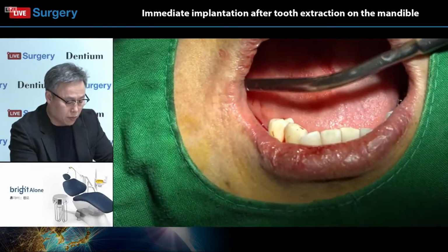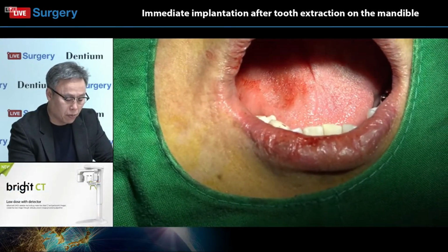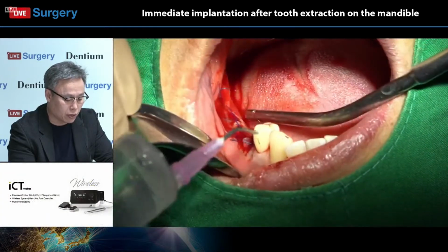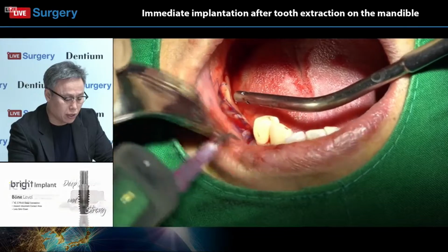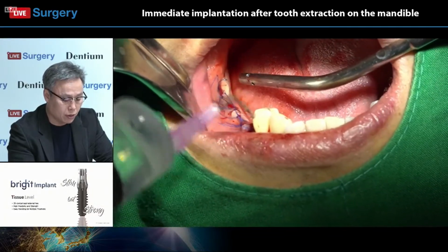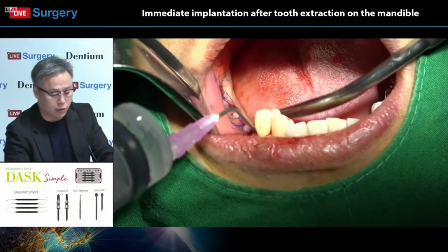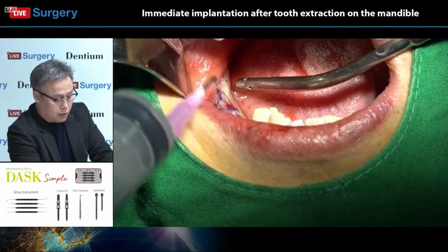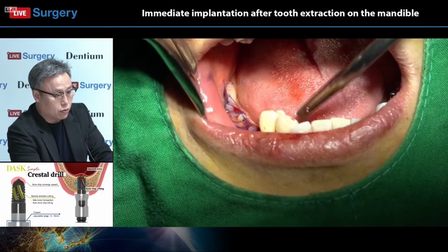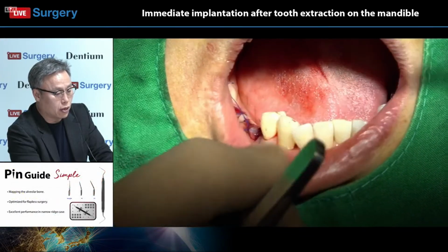Yeah, he's applying the PDRN. It's now available and popular in Korea. It's good for cell growth, angiogenesis, tissue oxygenation and has an anti-inflammatory effect. It's commonly extracted and purified from the gonads of salmon trout. PDRN is nowadays available in Korea and it's very popular for healing advancement.